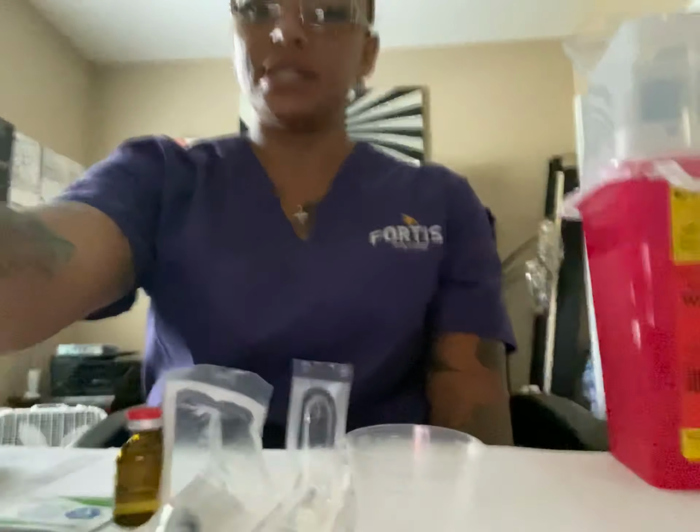Hello, student nurse Jack here, and today we're going to be withdrawing medication from a vial.